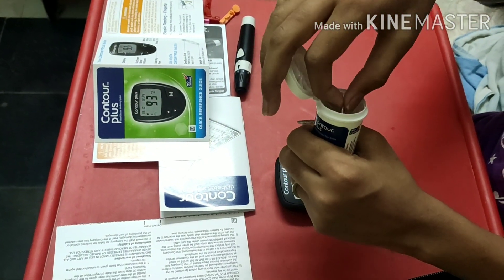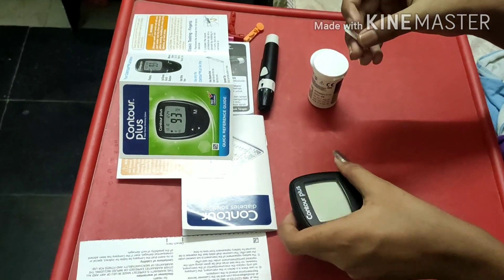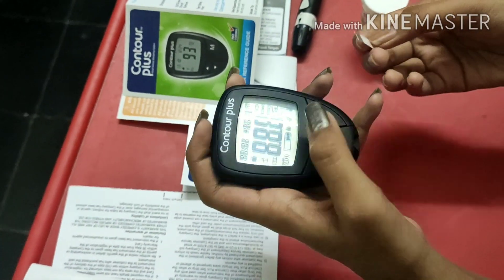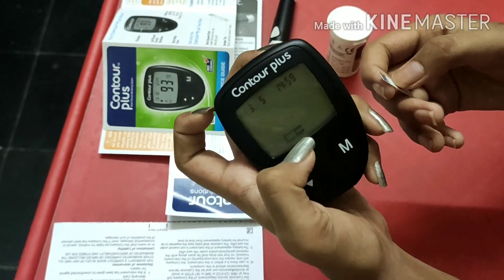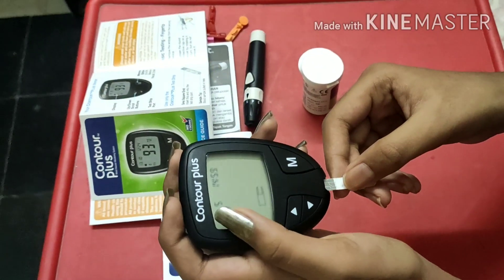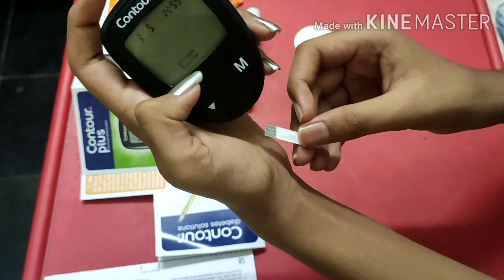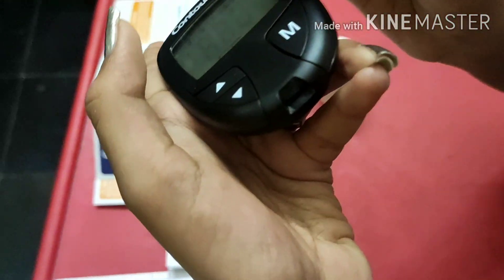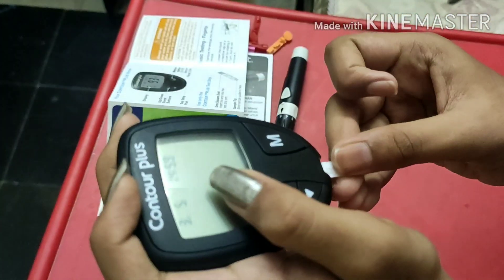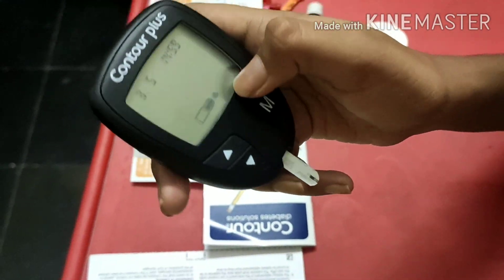Now take one glucose test strip and turn on the machine. You can see it is asking you to insert the glucose test strip. Insert it like this — there is a hole here where you insert the strip. It then asks you to give blood.